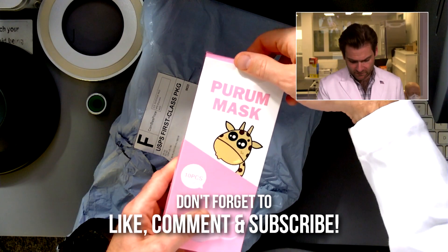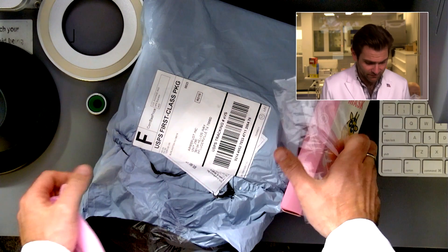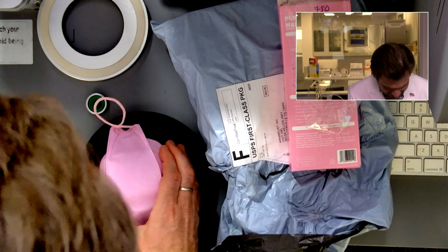Purum mask. Purum — is that supposed to be like 'pure'? The thing that's giving it away here is the fact that this is not a mask that KF94 folks would normally use. But I won't withhold my judgments here — I'm going to look into this.